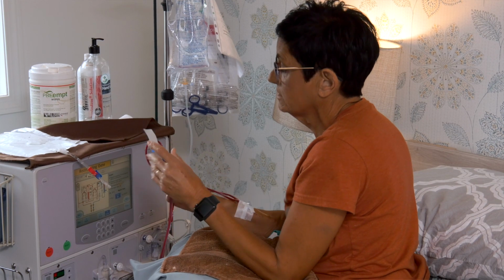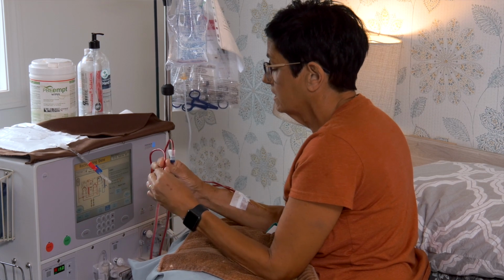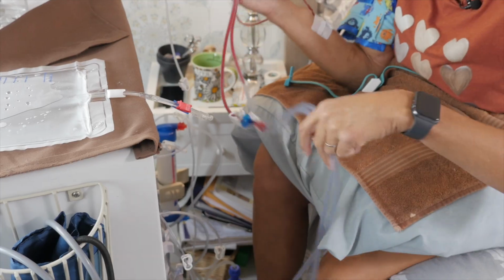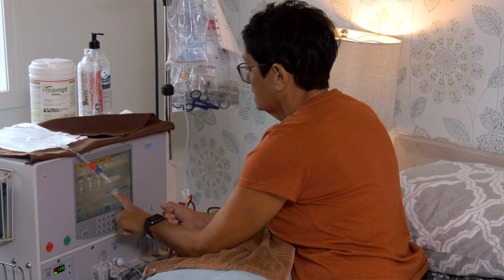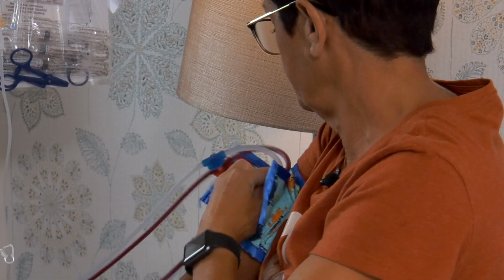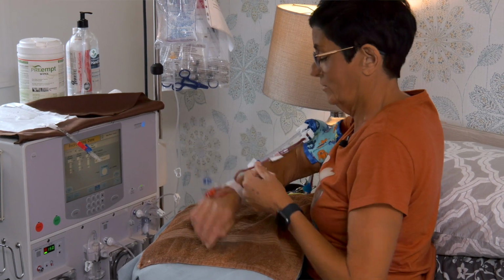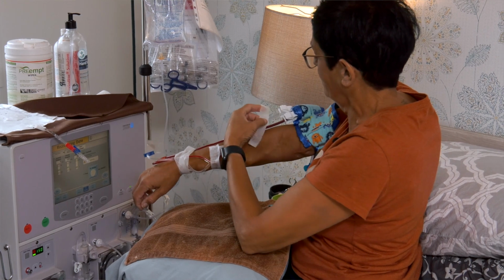Now I tape my connections because I sleep with my lines. I sleep during treatment. You don't want your lines separating. This just gives you a little peace of mind, I guess. And now I'll start treatment. Start. Use too much tape. But I can never have too much because then I can sleep better, right?